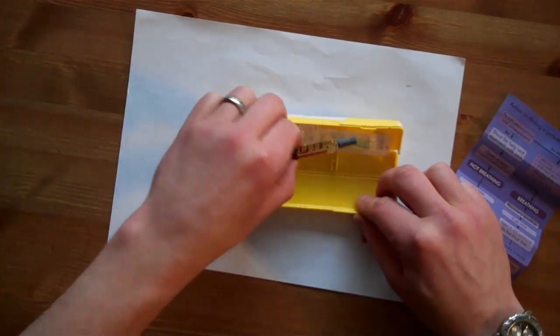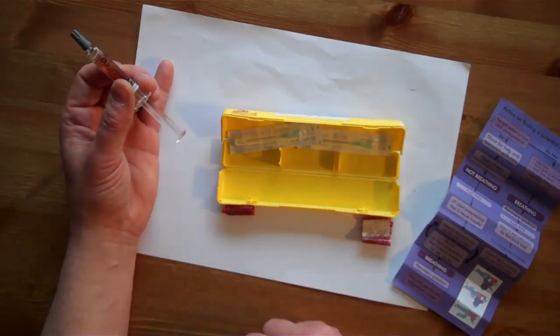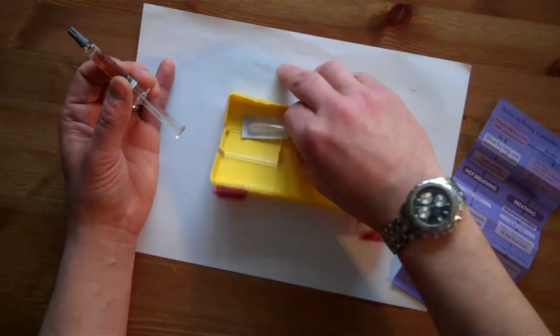We pick up the pre-filled syringe, removing it from the cradle inside the yellow box and we pick up one of the blue muscle needles.